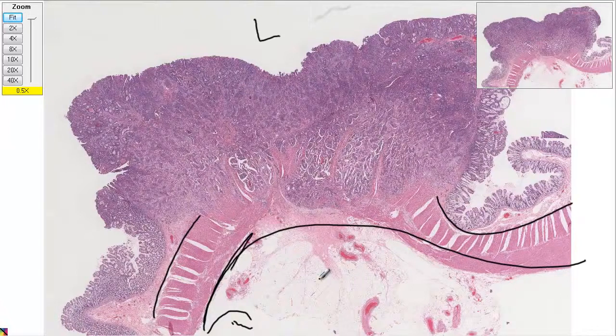So you can see the muscle looks all fine there. That's how thick it's supposed to be, and it all looks fine over here. On what scale? How thick is that muscle? Once again, our tiny little red blood cells are those little dots there. So we're talking about a thickness of a few millimeters, about 6 millimeters thick. That's actually a very, very strong muscle.